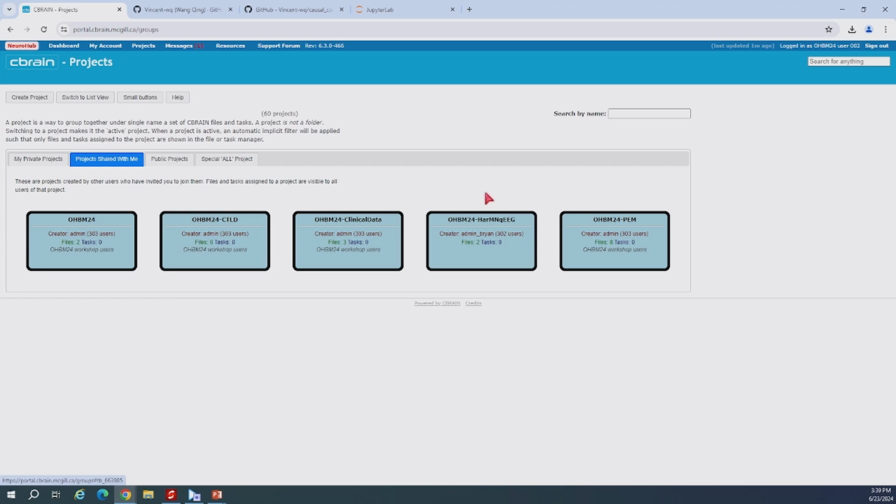So the classification equations that we can obtain with the harmonized qEEG are able to separate different groups much better than before, using only the log spectrum. The good thing is that our previous methodology is very compatible, very consistent with the new one. So we were doing well, but now we can do it better.